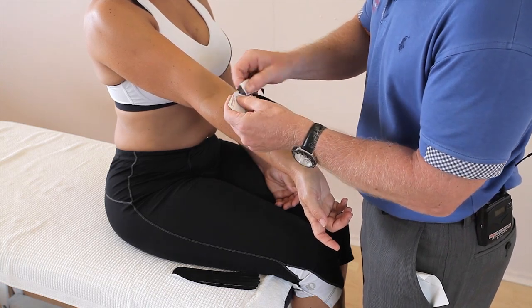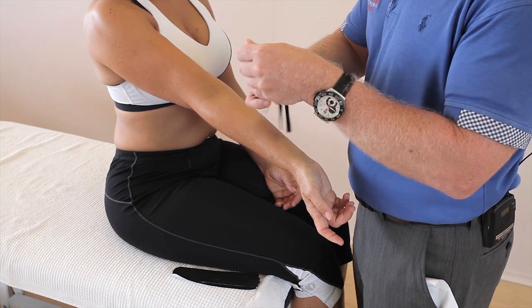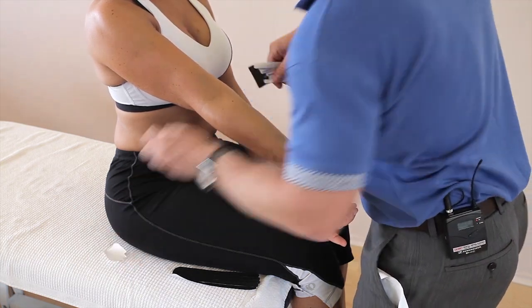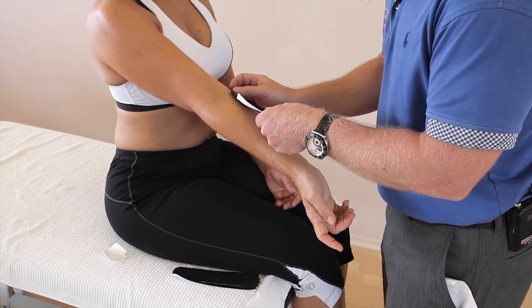Turn the tape over and individually break each of the fingers and apply the pad onto the medial side like so.